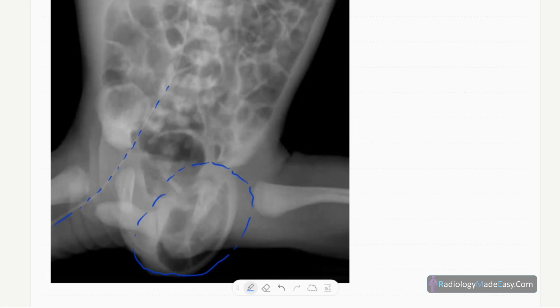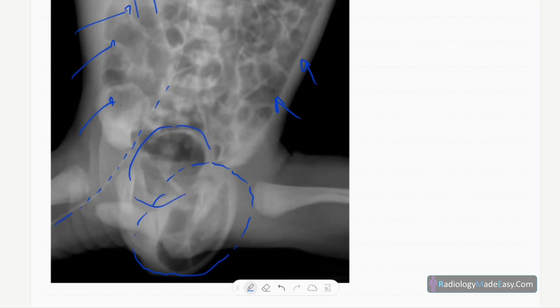Apart from that, you can see absent normal polygonal pattern of the bowel — the bowel loops are distended here. There are dilated bowel loops; however, they are dilated to some extent, and here also a dilated bowel loop.